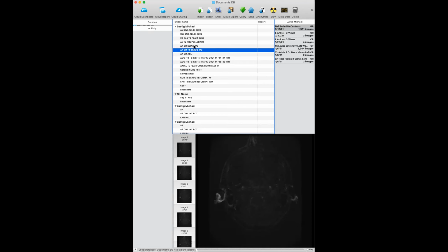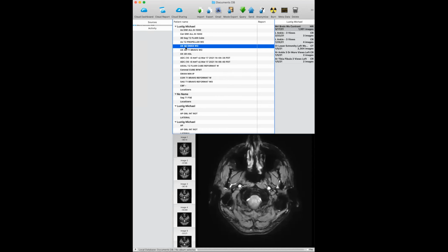Another one, and I'll show you all those images in a second. It's just hard to share multiple windows. Another one is axial 3D SWAN. This is susceptibility weighted angiography, it's called. We talked about susceptibility weighting, right? So effectively it's similar to T2 star, except that they also combine the phase image with the magnitude image. Remember with T2 star, you get dephasing and loss of signal. And then there's another effect, which is that the phase will be different based on your echo time. And so what they do is perform a combination of them in order to emphasize areas which have different susceptibility.